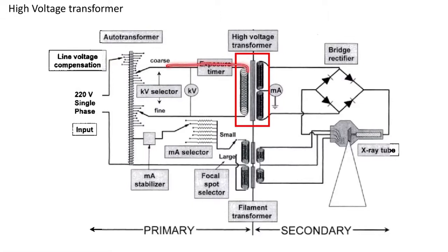So whatever signal we had here, which came in from the power supply, made it through our auto transformer, and then eventually made it to these windings of our high voltage transformer, will be increased so that what comes out of this side on these wires will be high voltage AC. It would be amplified by some factor.